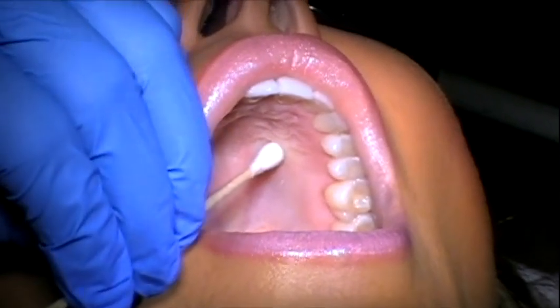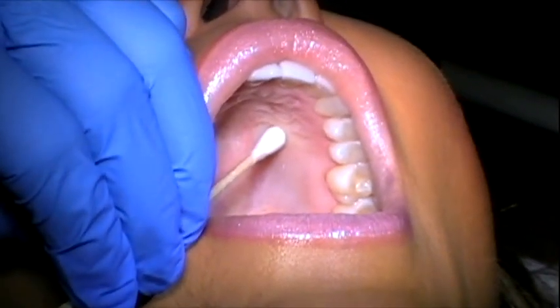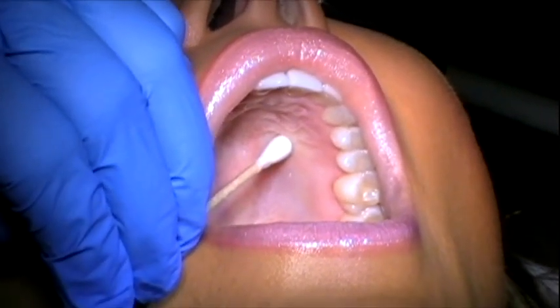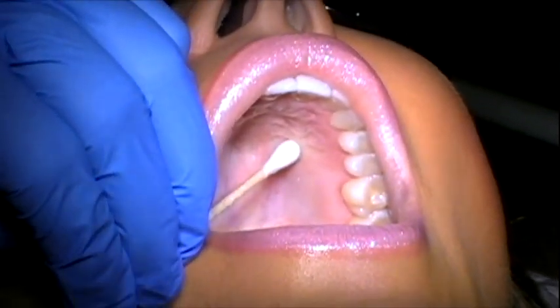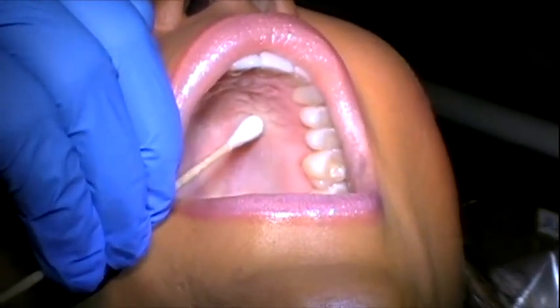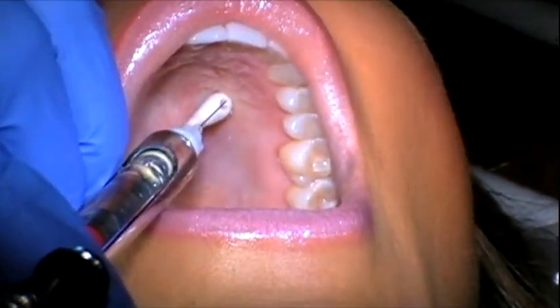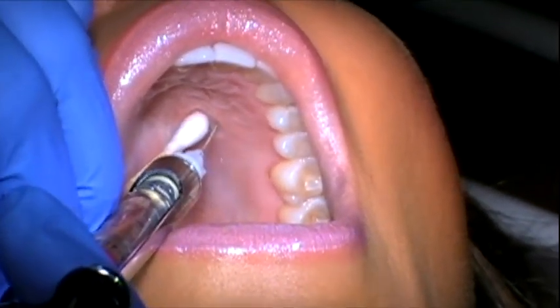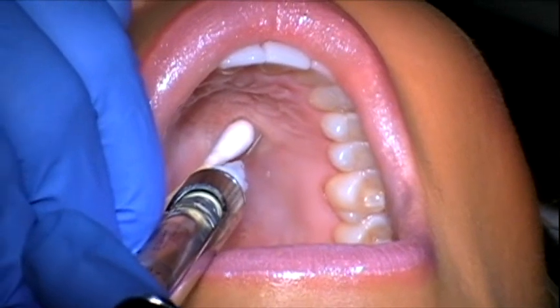On the facial side, it only gets the gingiva of the premolars, the canine, and the incisors — it does not get the lip, so that's one of the advantages because the patient is going to be able to smile and the lip won't be numb. The depth for this is going to be about four millimeters. After about one minute of pressure, make sure you hold the q-tip in such a way that you've left an open path for the syringe to come in and you're not blocking your own way.